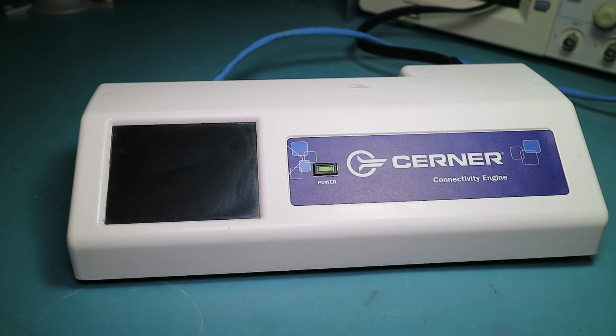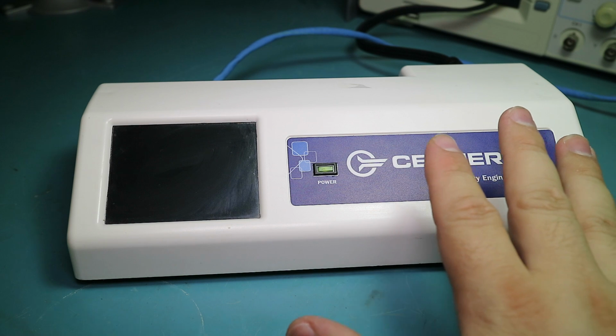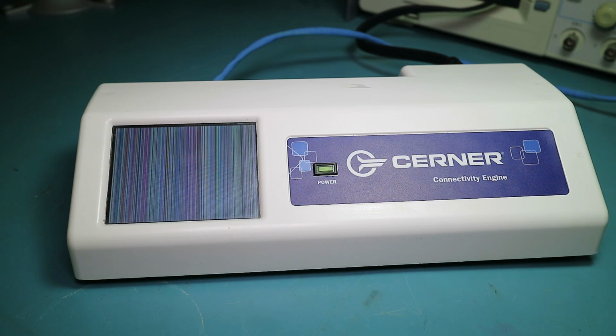Today I'm going to take a look at this Cerner. I'm just going to call it Cerner. I don't know what it's supposed to be, how it's supposed to be pronounced, but this Cerner connectivity engine. From what I can tell from the literature, this is a device used to connect a whole bunch of stuff in a hospital, particularly at the reception.